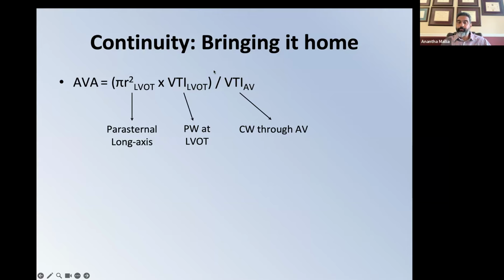Okay, so there you go. Quick and dirty on how to identify aortic stenosis pathophysiology and how to measure and estimate the severity. So like I said, even though this is well within your scope of skill and knowledge, this is still something that once you identify the pathophysiology, get that formal echo to get confirmation and to get more formal numbers.